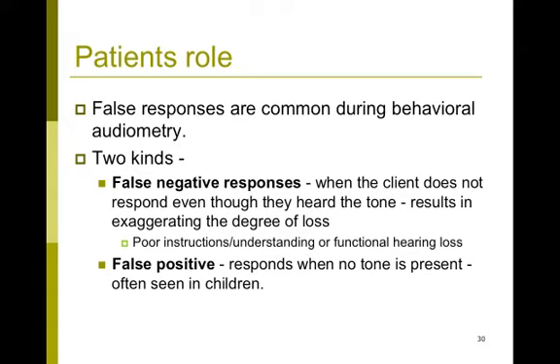One is a false negative response. Here, the patient does not respond even though they actually heard the tone. So the patient's response is negative, but that's false. What it does when you're trying to assess this individual is exaggerate their degree of hearing loss. Another kind of false response is a false positive response. Here, the patient responds that they heard the tone even though you weren't presenting a tone, or there was no tone given.